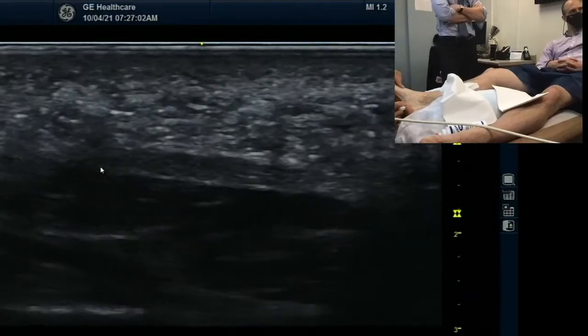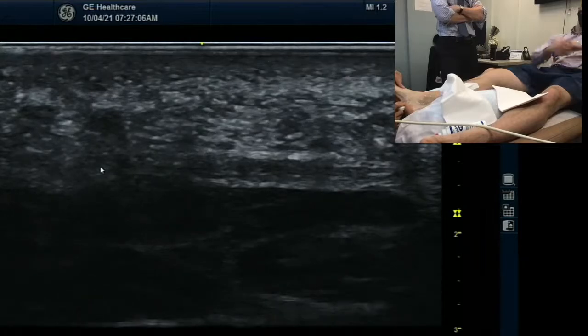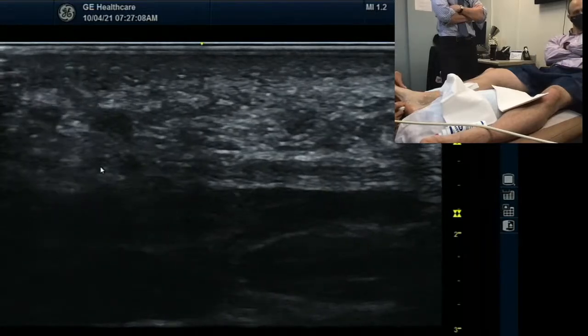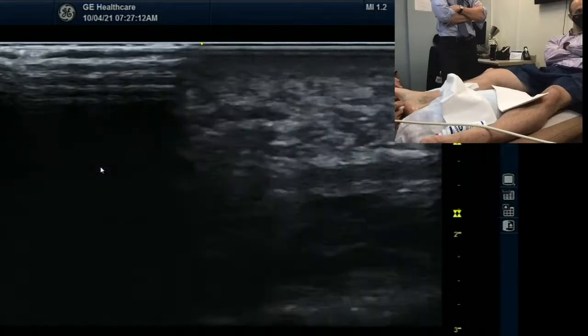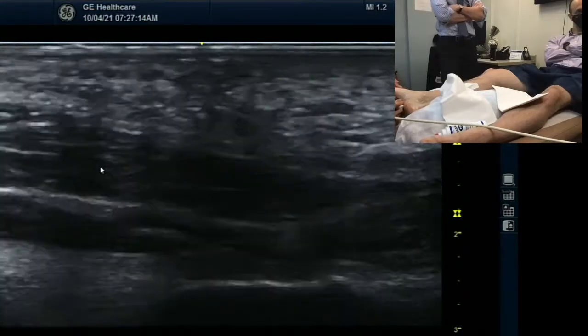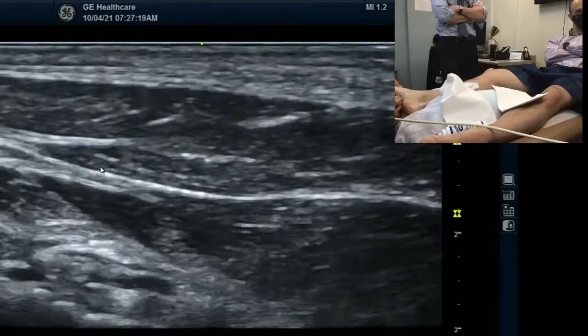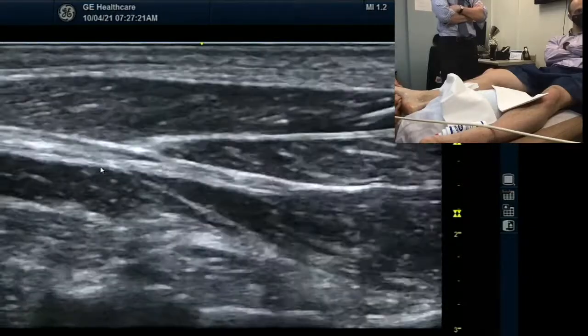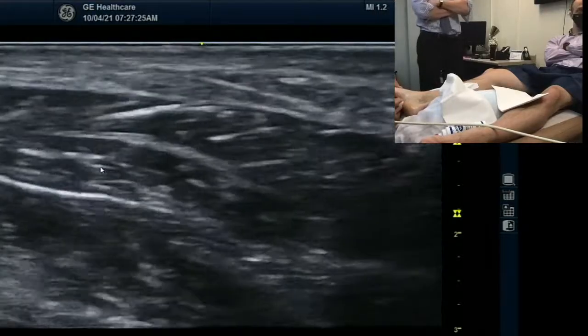When you have plantar fasciitis, what happens on the ultrasound? If he has plantar fasciopathy or plantar fasciitis, it'll be thicker. But right now I'm also doing sonopalpation the entire time. So I'm not getting pain or eliciting pain out of him. No pain. Could you name the superficial and deep muscles on the screen? Yeah, so that's actually something I'm learning right now.